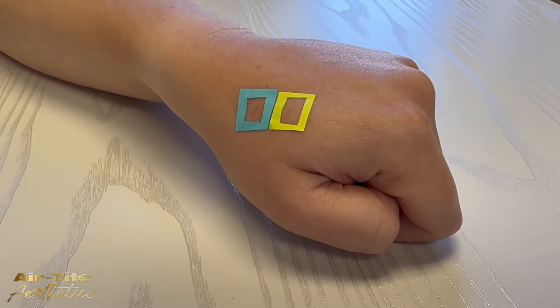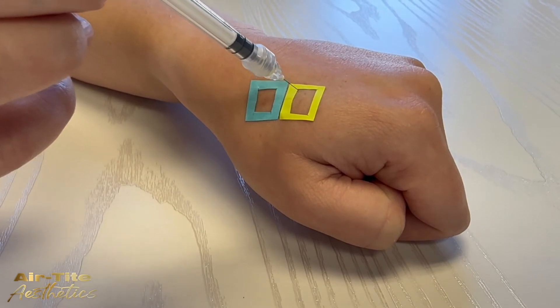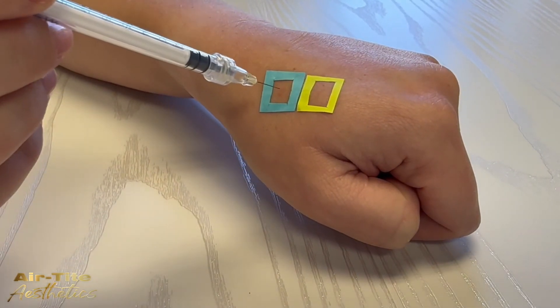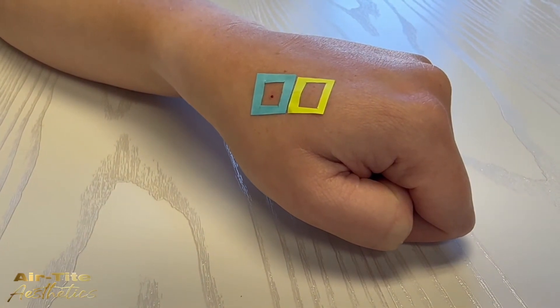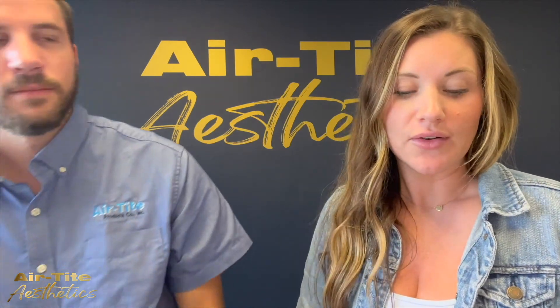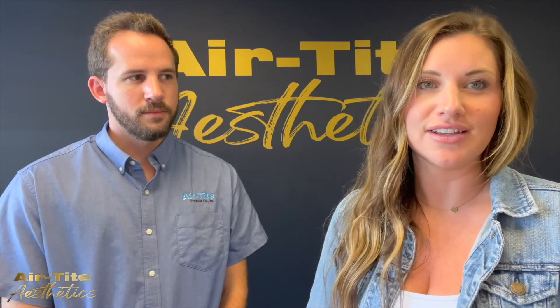Here we will compare the invisible needle to a 30 gauge needle. This is the invisible needle going into the yellow square, and now we have the 30 gauge — that's what you will typically see being used for Botox injections. Oh, that was a pinch. And as you can see, there is bleeding where with the invisible needle there was none. If you imagine being in the face, you've got a lot more blood vessels to worry about and it's easier to bleed and bruise, so the invisible needle is way more comfortable, and again, you're not losing that product.